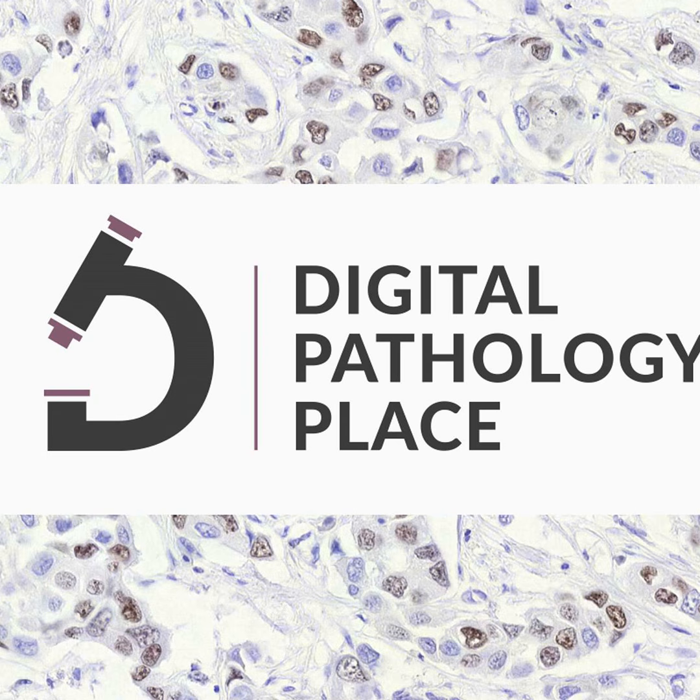Let's have a look. What I like very much here is they have these different levels. We are starting with level 1, which is our morphology layer, what we see. Then level 2 is the AI computational layer, where the molecular prediction from H&E is happening. But what they say is we also need the ground truth. And I am not talking about annotations by pathologists. We are talking about spatial omics grounding the AI.